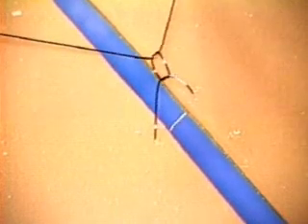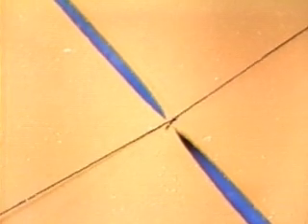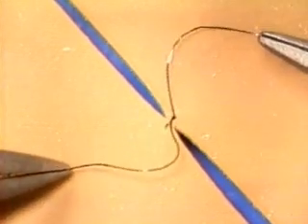The first is to make a surgeon's knot with a double loop on the first half knot. That's good, but when you're first starting out, a double loop can be quite troublesome. The second way to avoid premature locking, which doesn't call for a double loop, is this. Instead of pulling upwards on the two threads at the same time, pull sideways, first on the short end, then on the long end. Let's see that again in slow motion.